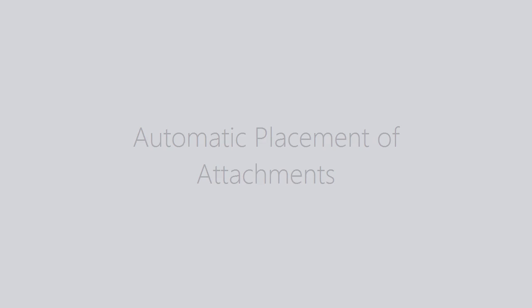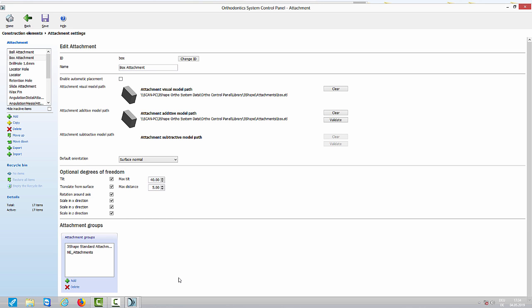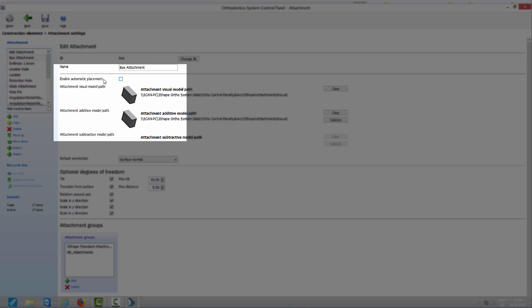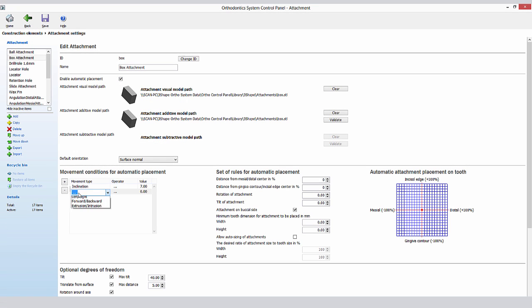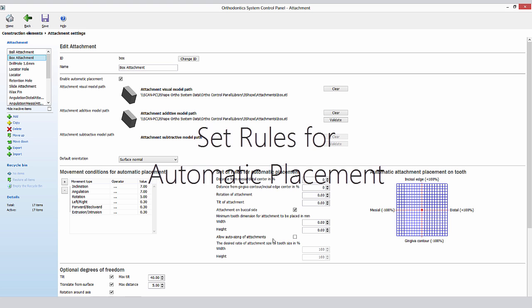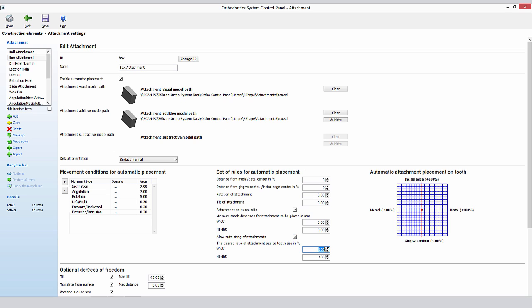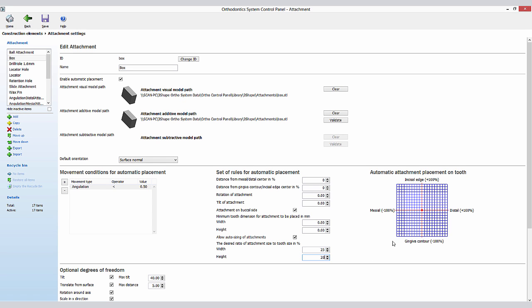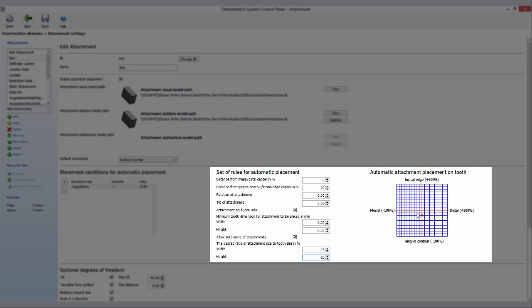The control panel also has a new feature for automated placement of attachments. You select the attachment and determine the movement conditions for automated placement. A click on the first column, Movement Type, defines the values you wish to use. Six different movements can be selected. We can create rules for automated placement — size, height, and position can be determined, and the blue grid box on the right side allows the user to visualize and control these settings.